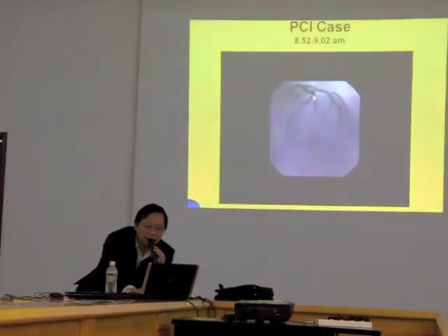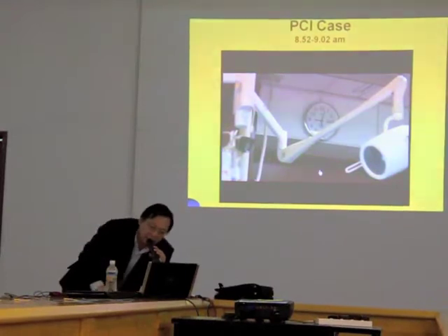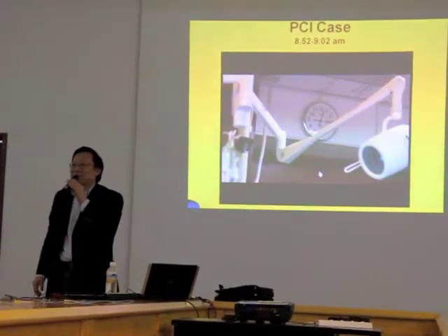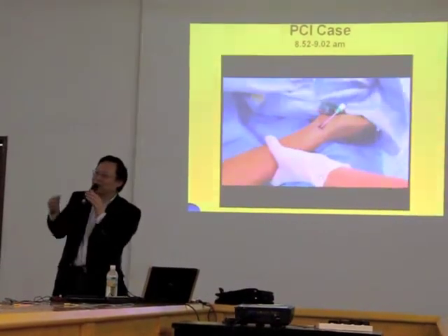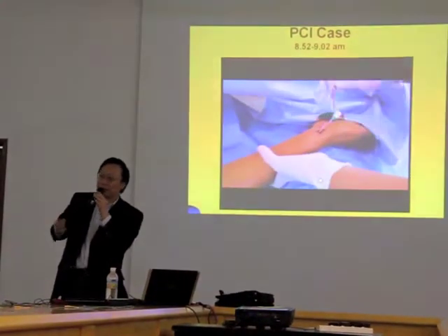This is now the result. There was a narrowing of about 80-90%, and now it's opened up. You can see the flow going down very fast. From beginning to end — ten minutes.